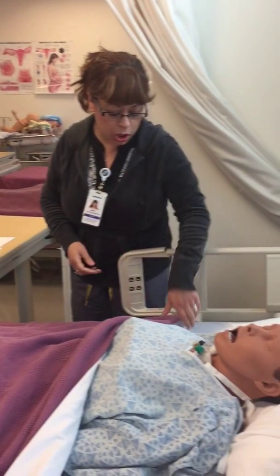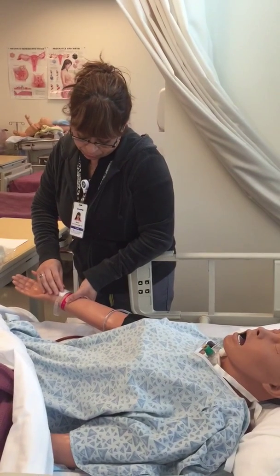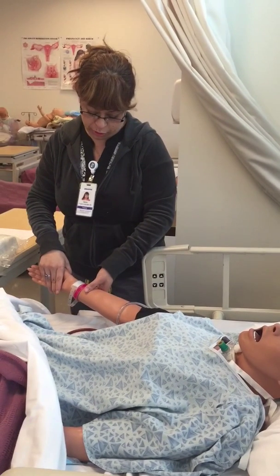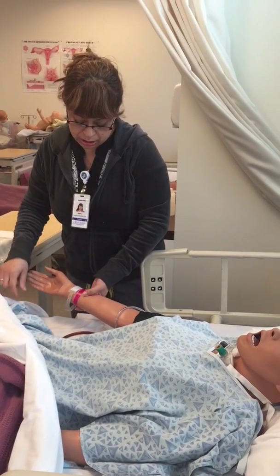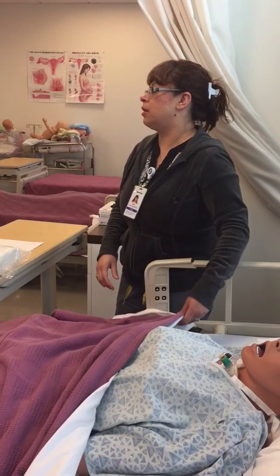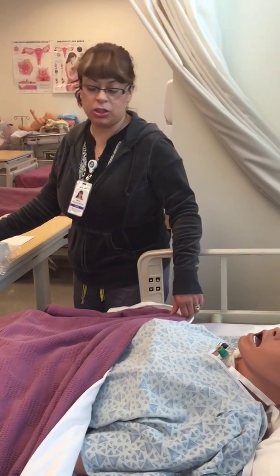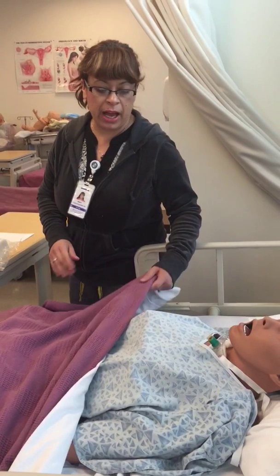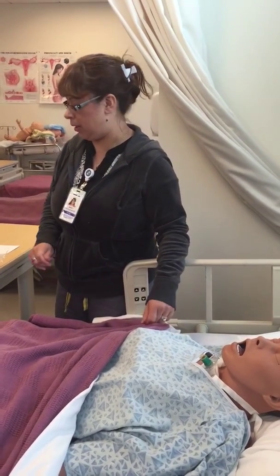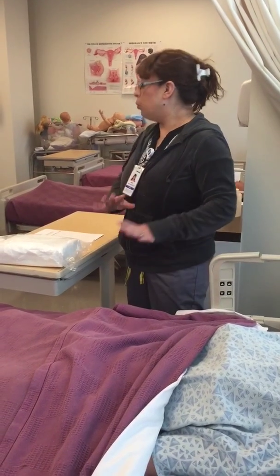Mrs. Smith, we're going to go ahead and start, but I do want to identify your name. So identify the patient, and this is Mrs. Smith Ivana. Can you tell me your date of birth? 9949. And do you have any allergies? Okay, she's allergic to penicillin. And why is allergies important to ask her? What is in here? Yeah, betadine. So I want to make sure she's not allergic to betadine. So you've never had any allergic reaction or sensitivity to betadine, right? No. Okay. Because we do have betadine in here. We use it as a cleaning agent. So we established all that.